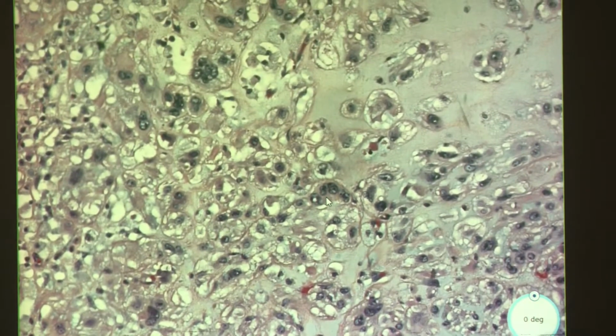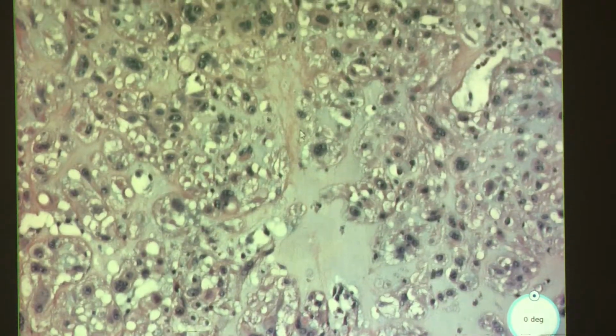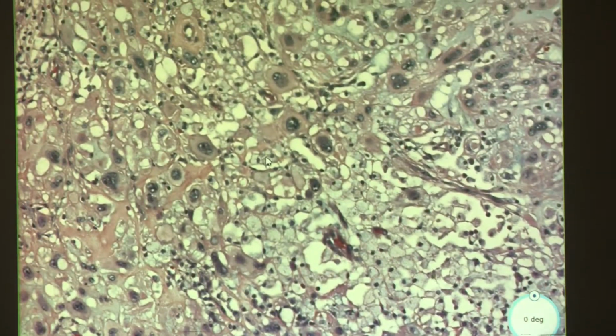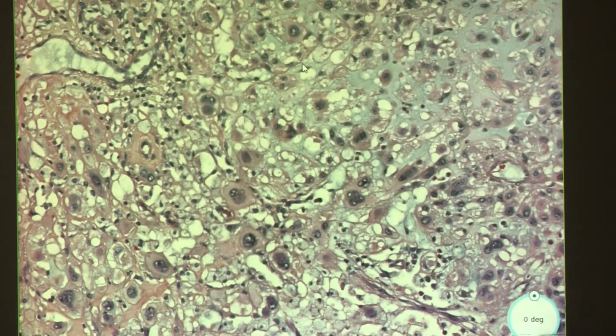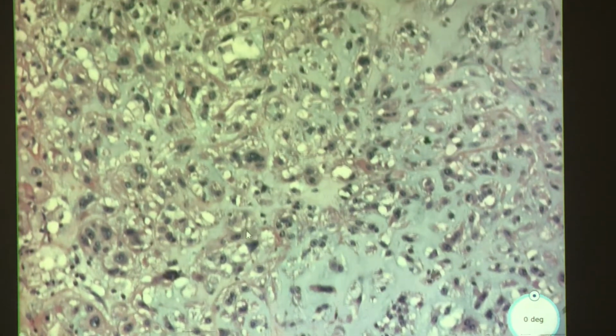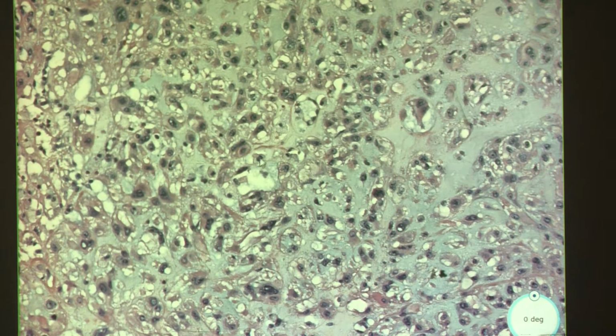And trying to see if we see any other features that might help us out. If anyone knows what we're looking at, feel free to scream it out. Okay, I'm not really seeing too much of them. Like maybe this one's trying to.